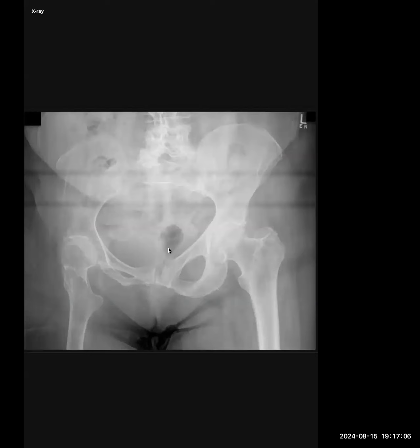It's a known case of poliomyelitis. And yes, you were right about the differential. Something like ALS or other neuromuscular disorder can also present like this.